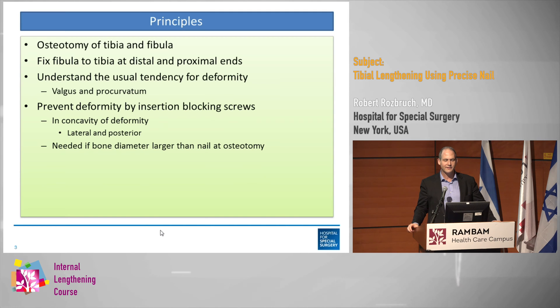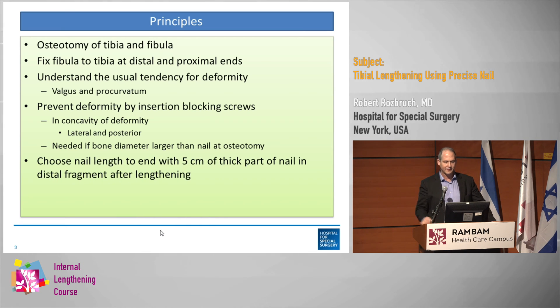You should understand the usual tendencies for what kind of deformity happens with lengthening. Valgus and procurvatum are the things that typically happen in the tibia when left to its own natural tendencies. You can use blocking screws to prevent this by placing them in the concavity of the deformity, which would be lateral and posterior. This is particularly needed if the nail diameter is less than the intramedullary diameter at the osteotomy site.